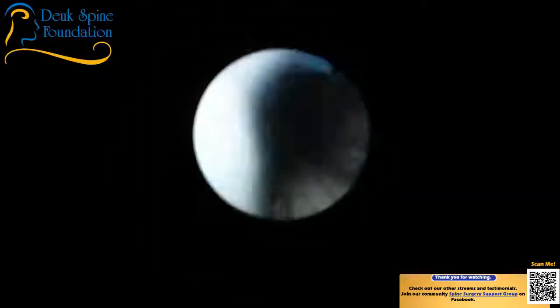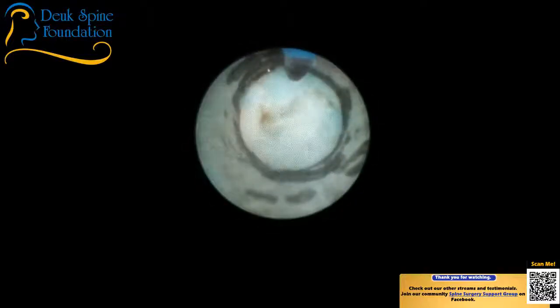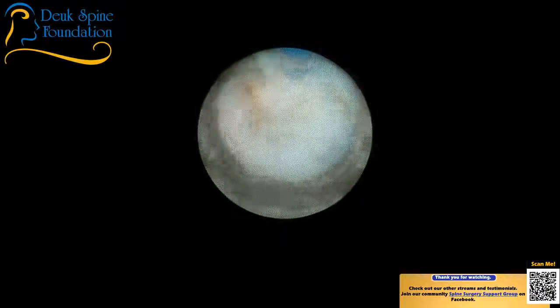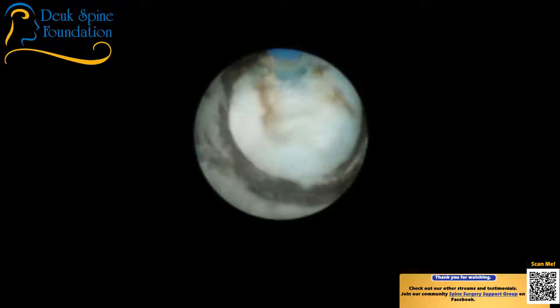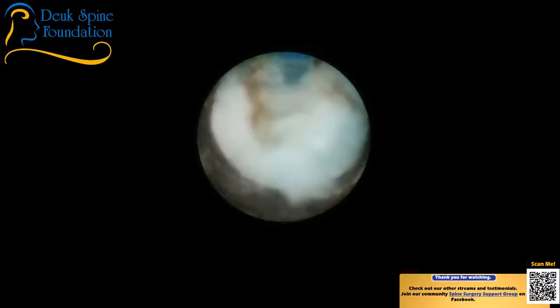All right, right now, there's a herniation just shot out from the tear in the back of the disc. And of course, I'm going to go carefully at the beginning because we've already verified that our instrument is not in too far. In too far means bad for the spinal cord or nerve. But I'm seeing fibers down there that look to me like posterior longitudinal ligament. So I just want to be real careful.